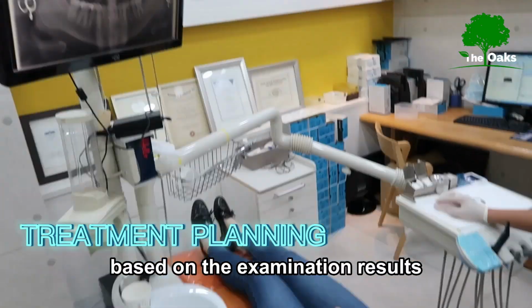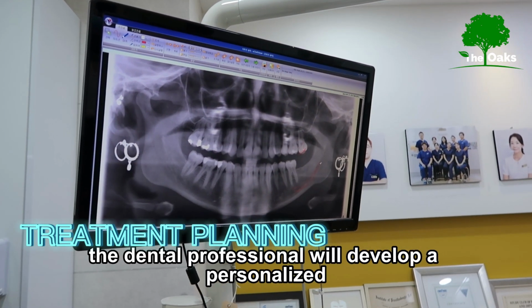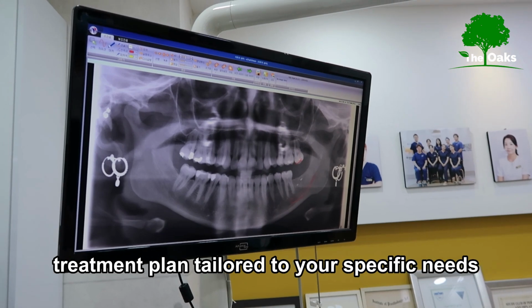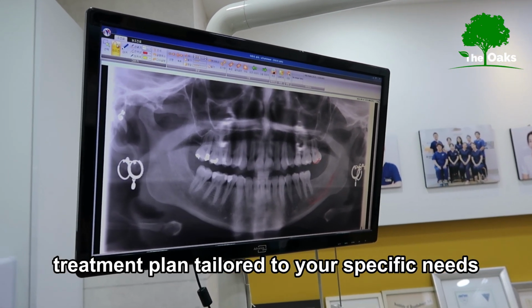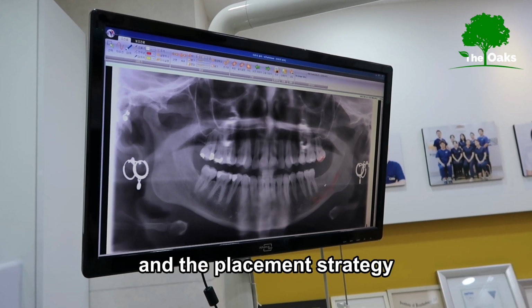Treatment planning. Based on the examination results, the dental professional will develop a personalized treatment plan tailored to your specific needs. This plan will outline the number of implants required and the placement strategy.